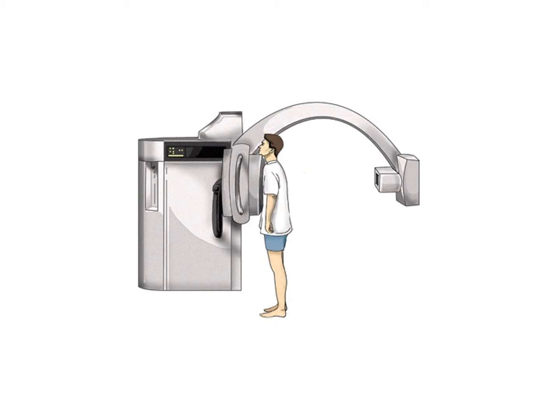The X-rays shoot out from that arm on the right side, like a beam of electromagnetic waves that radiate from that tube, which electrical currents are passed through, and then they're scattered onto the film. The film in this case would be on the front part of his chest, where the X-ray produces its image.